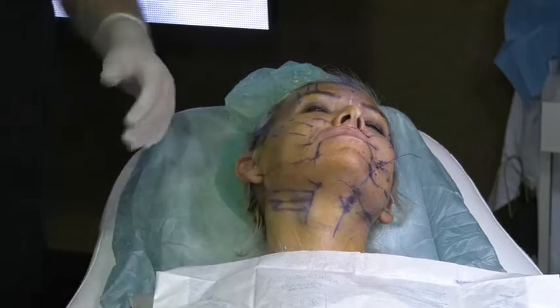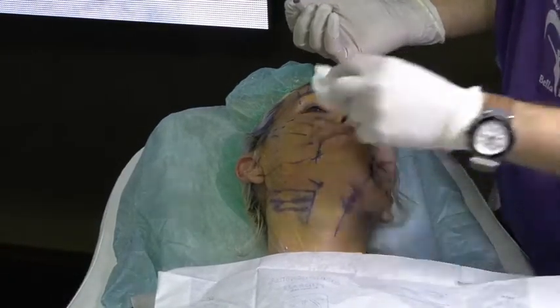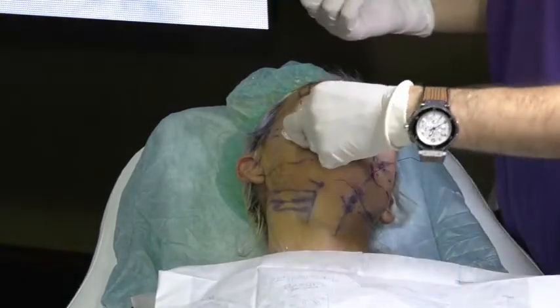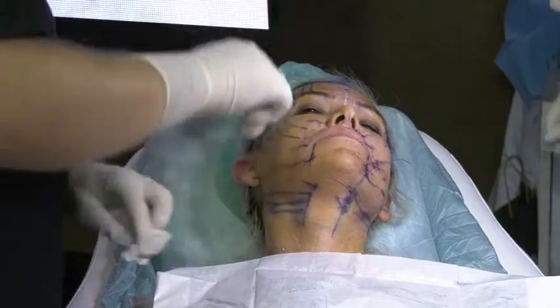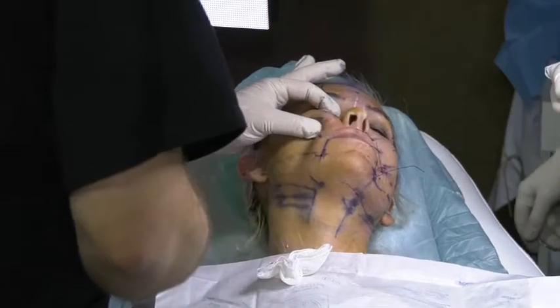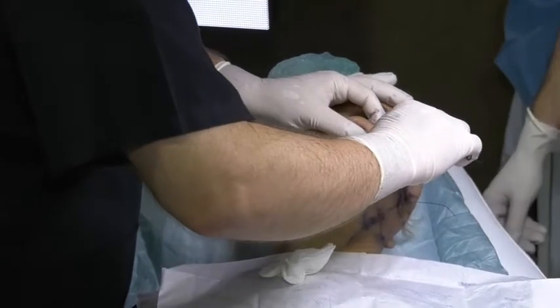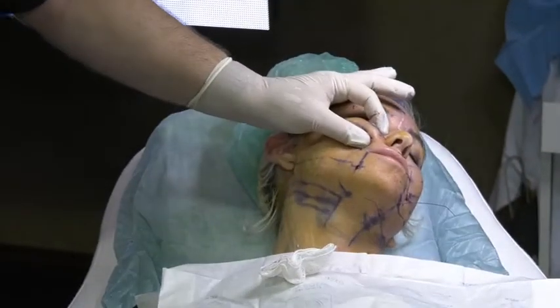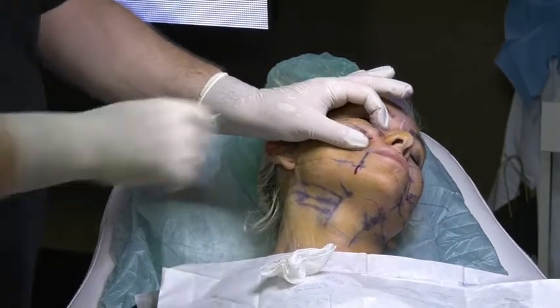I always work from the right side. Unless you are left-handed, you can move to that way, but it's always easier for you from the right side. Okay, number 1, I hold the cannula, I pinch the skin, you see, it will be dead. You hold the cannula, I pinch, I go. My hand is near, guys. If you are here, it's difficult. Your hand should be near, okay?